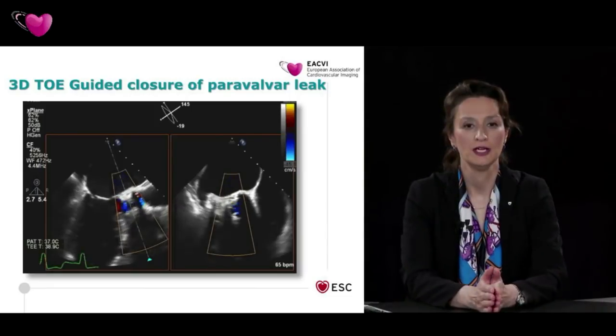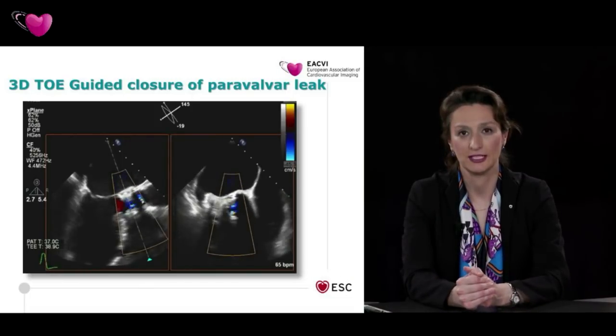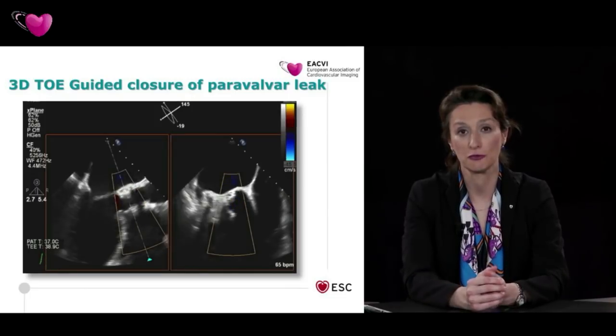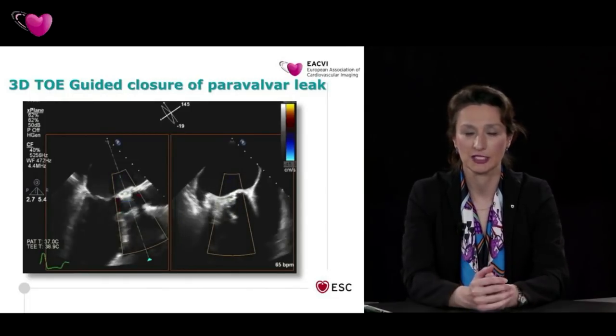That's very good. And indeed, as you have heard, fusion imaging is another imaging modality that is coming into the clinical field, where you can overlay echocardiographic images on fluoro and help sometimes the communication, most of the time the communication between the interventionalists and the imagers.